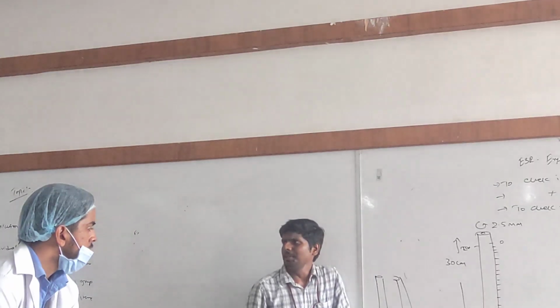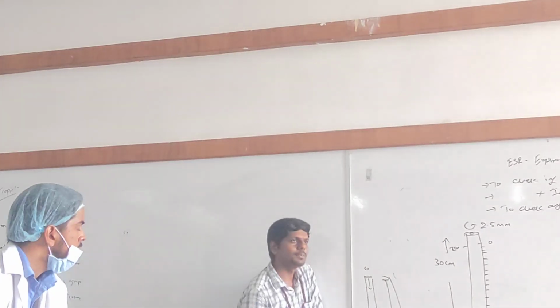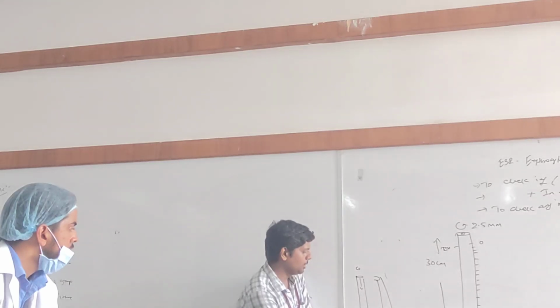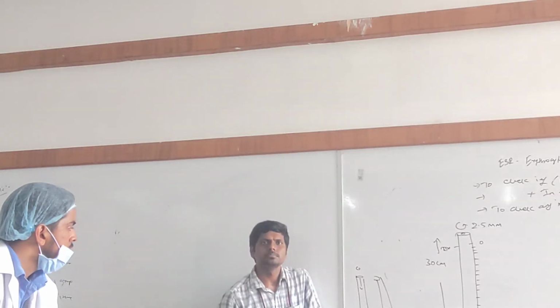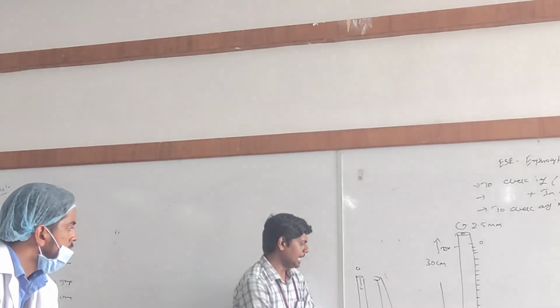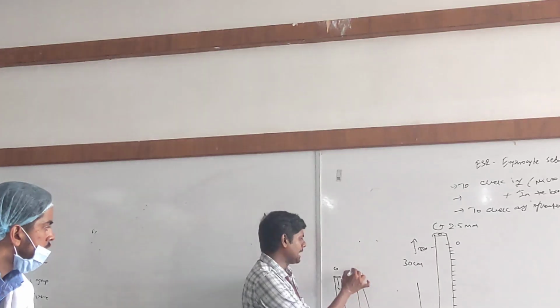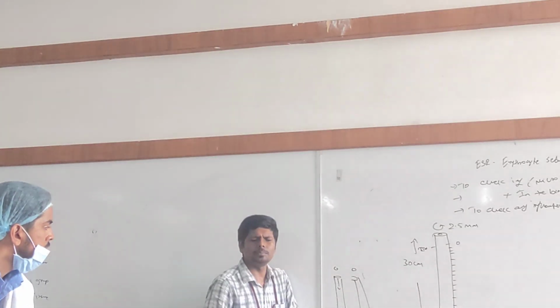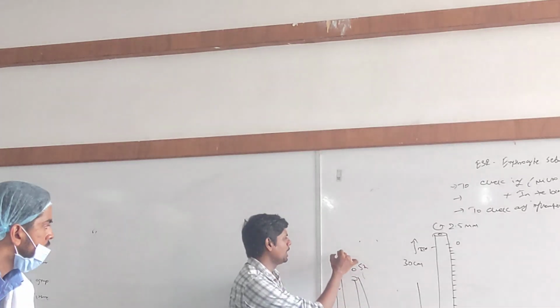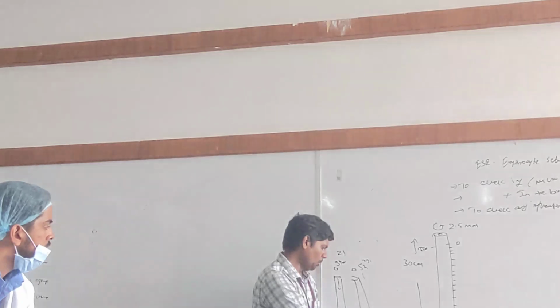Imagine we suspend a stone in the water. It will take 2 seconds to reach the bottom. Then this is the fevicol solution in the second glass tube. Here I drop the same 2 gram stone. How much time will it take for this stone to reach the bottom?